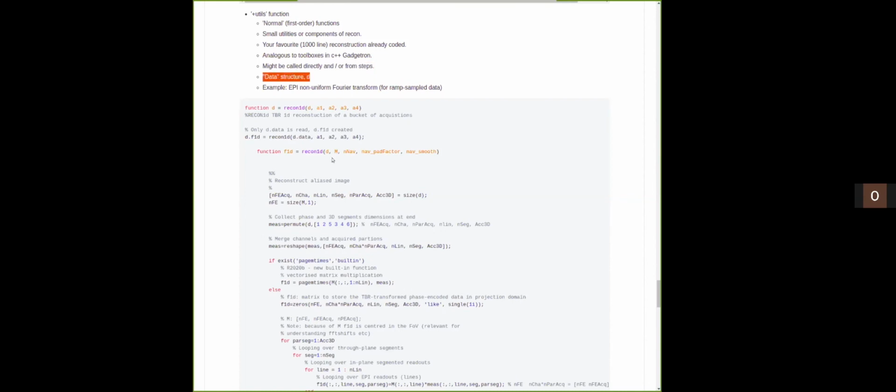And to stress this, the data structure D for data. So we're passing D, returning D. And this little shim layer in between here is just to really stress the fact that it's data being passed and then first Fourier transform data that are returned from here. So this was just a wrapper around an existing function.